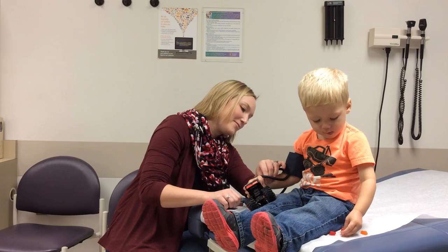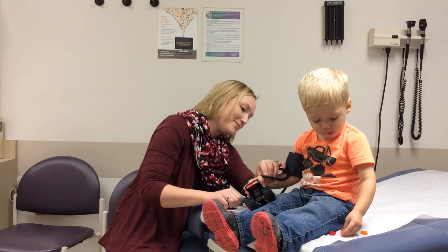The cuff should be placed next to skin and not over clothing. Support the patient's arm at the level of their heart.